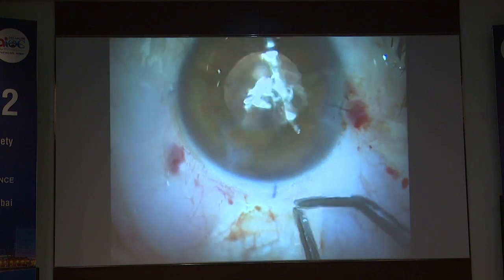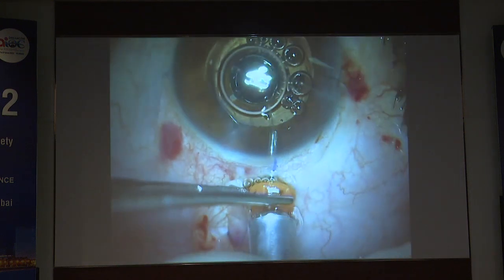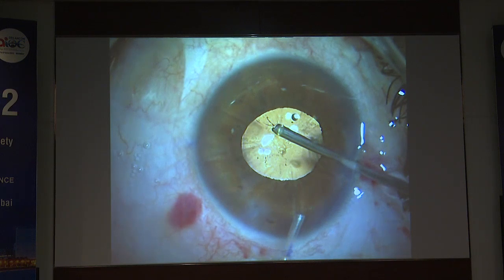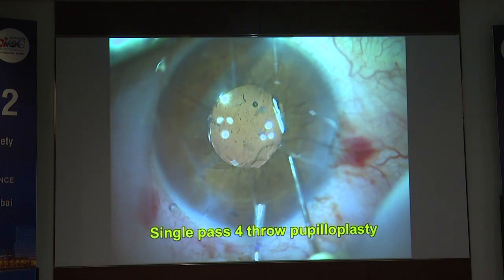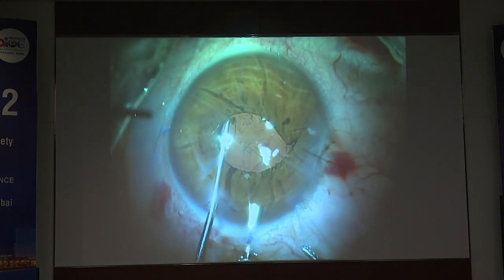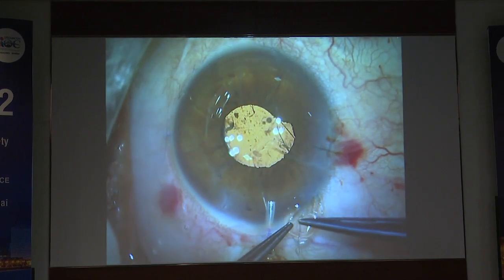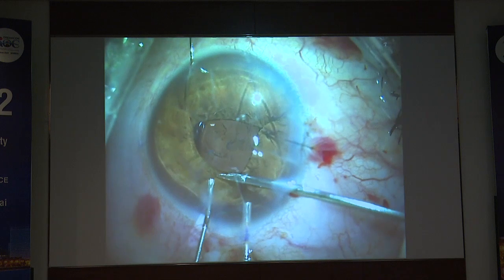The answer is simple — we want to make that iris into a pinhole. A Trocar AC maintainer is fixed to keep fluid in the eye. Passing the needle straight through clear cornea from one side, and from the other side of the paracentesis, a 30-gauge needle is used to railroad the two. The loop is brought out through the paracentesis. This is single-pass, four-throw pupilloplasty — pass through that loop four times, then pull and cut with a micro scissor.